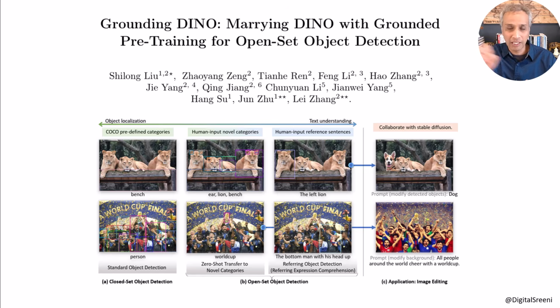You'll look at those later on, so if you're not from a pathology background, let's say you have glomerulus or proximal tubule. Using a text encoder, it matches those language features against the image features. And again, this is exactly what enables open vocabulary detection in general.